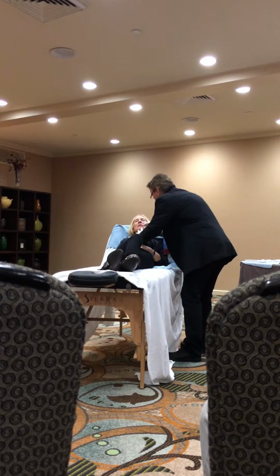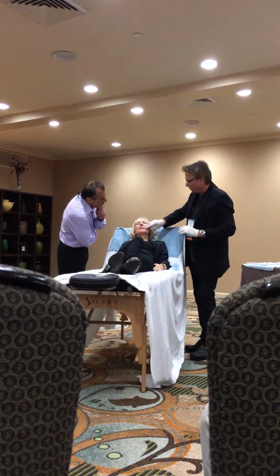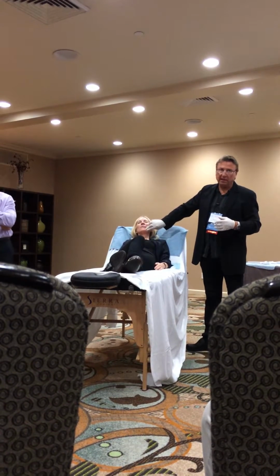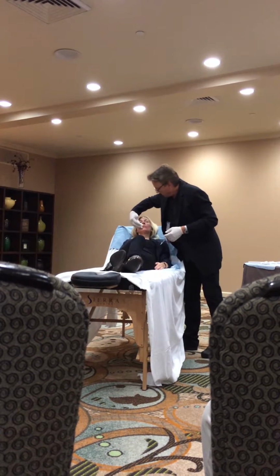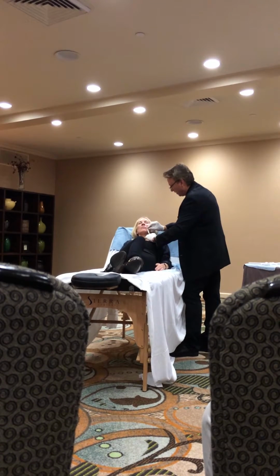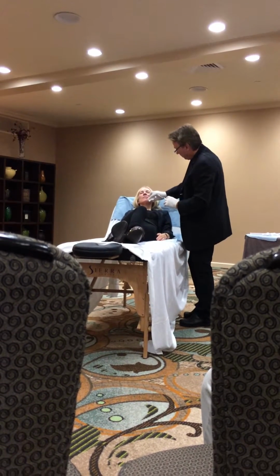Okay, the other thing I do, and I'm sure Peter will comment on this, I go up like this, I push some product up, and I can actually curl the side of the mouth up a little bit on a lot of people, provided they're not too lax. If they're too lax and their mouth is going down and they need a sharp lift, then you can do all that you want, and you're not going to get that effect. So you see what I did? I went right about here, and I go up above the lip, and then I inject as I'm going up and pulling out. And I can actually get a little bit of a curl effect with the skin. Okay.